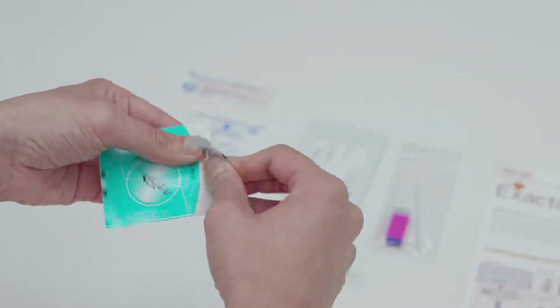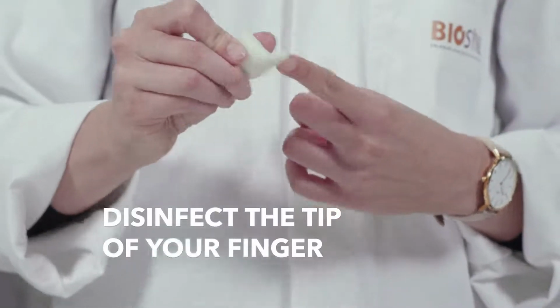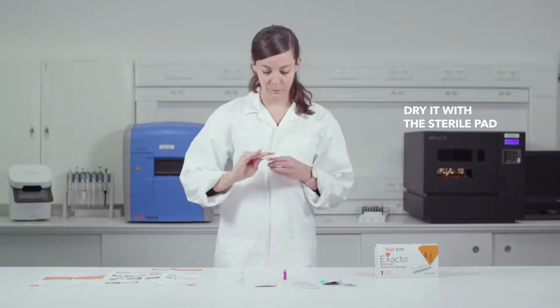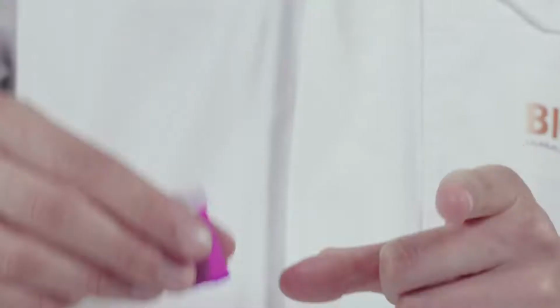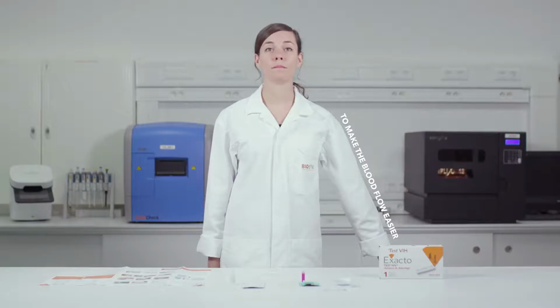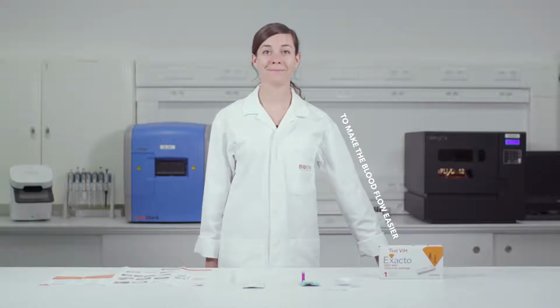Open the alcohol wipe and the sterile pad. Disinfect the tip of your finger with the alcohol wipe. Dry off any excess moisture with the sterile pad. Remove the cap from the lancet. To get the blood flowing easier, let your arm hang down by your side.